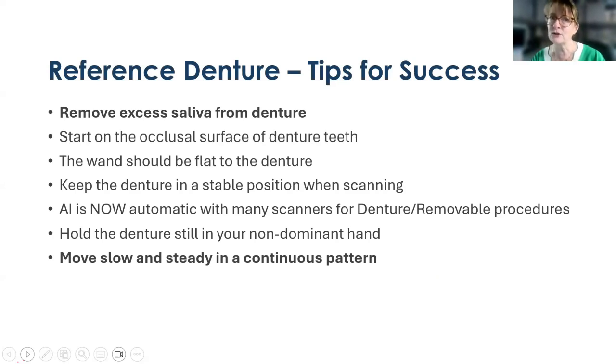And Yen mentioned earlier, you want to make sure that the intraoral cavity is very dry, that there are no saliva bubbles. So, 2x2s are going to be your friend. And physically wipe off the gingiva, wipe off the tissue before you start to scan intraorally.